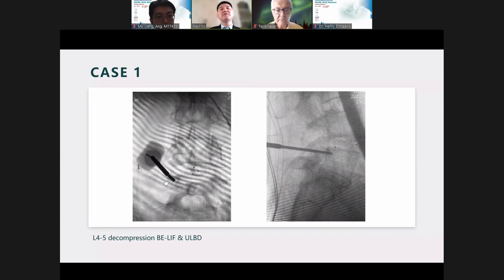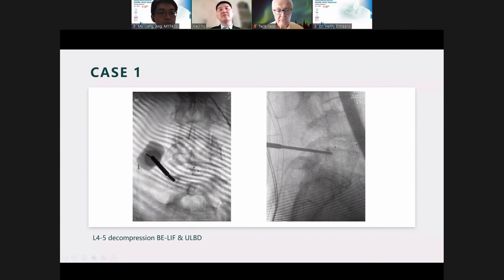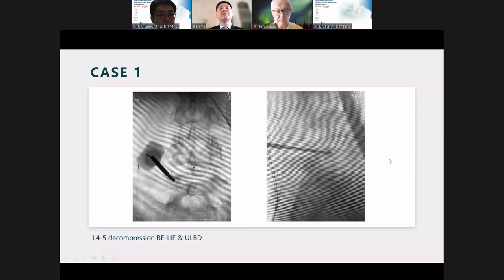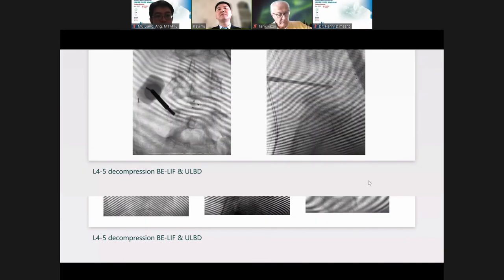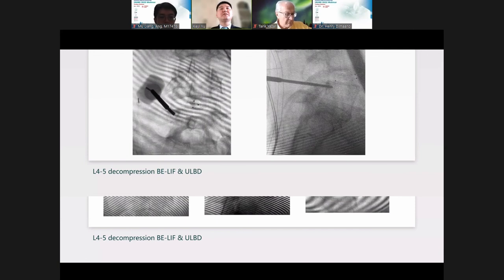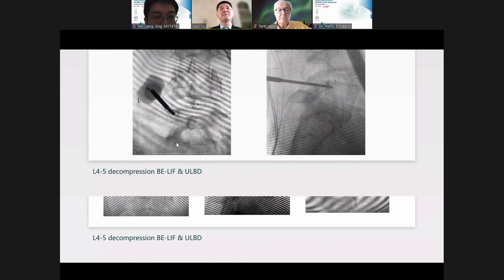If you are an experienced surgeon, through this endoscopic view you can make the screw canal very easily — without any additional X-ray radiation. Here is the L4 pedicle screw insertion, and also the right side pedicle screw — all under endoscope. Usually we can make a smaller incision than traditional percutaneous pedicle screw insertion because we can visualize, tap the entry point, see the tip and bottom of the tap, and place the screw — all under endoscope. No more X-ray needed when the position is confirmed good.